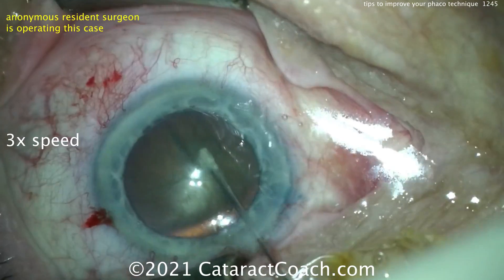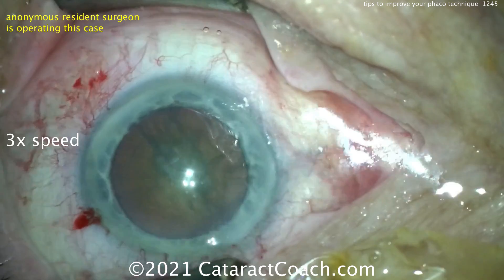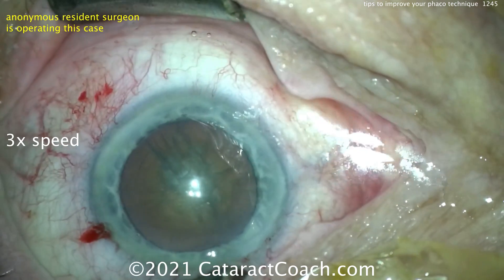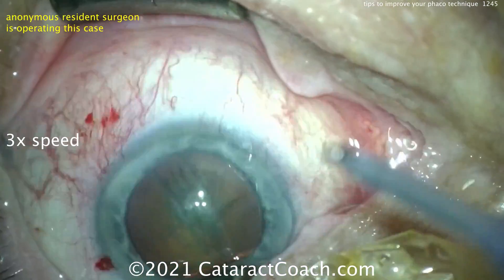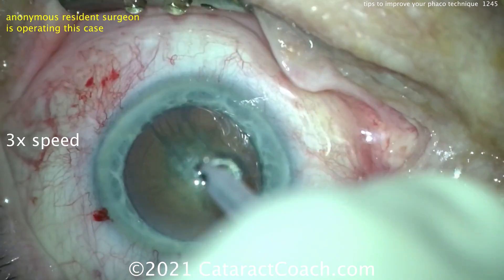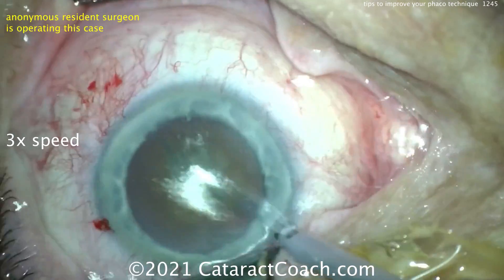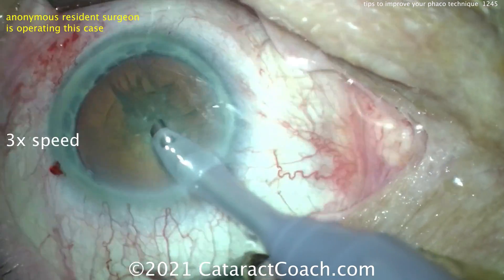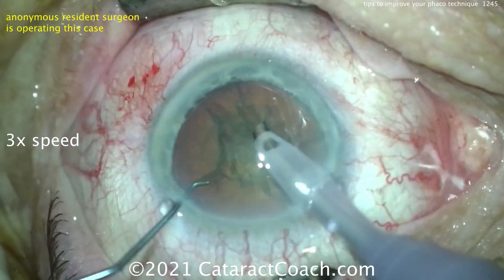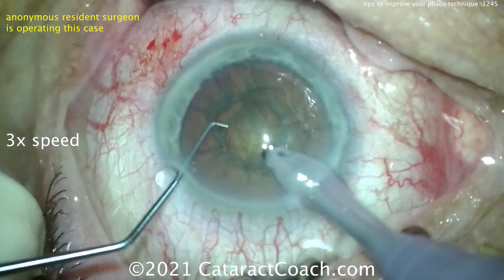Now look at the tear film — look at that nasal debris, all that fluid building up with the oils from the tear film. It looks like the eyelid margin was not well sequestered, so again that's just going to make your view even worse. You're 20 cases in and you want all the help you can get. Let's see the phaco probe — and again, get that speculum out of your way a little bit.